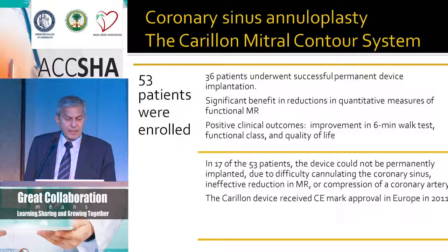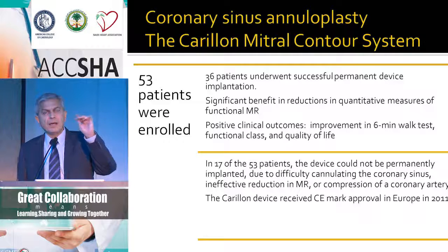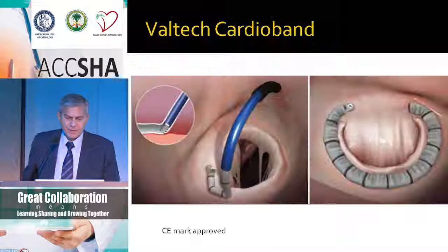That's because the coronary sinus is not always at the level of the annulus. The coronary sinus, about 20% of the time, is not at the level of the annulus. That's why these technologies are not always guaranteed to be successful working through the coronary sinus.